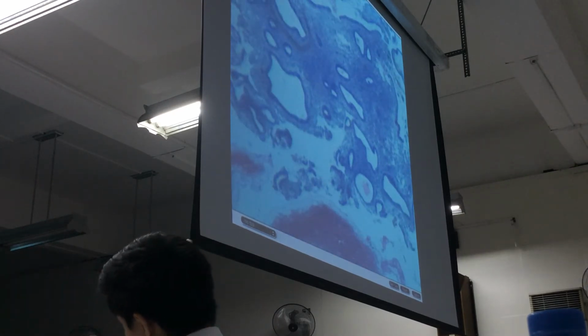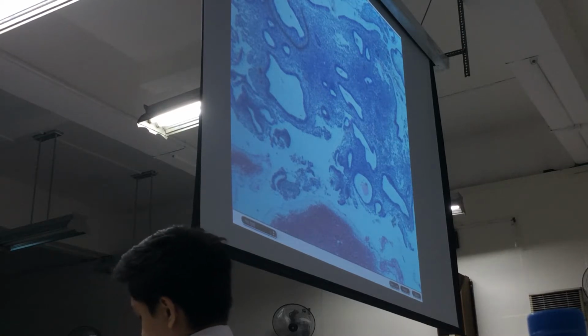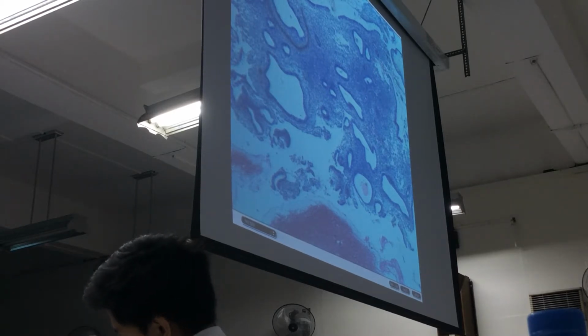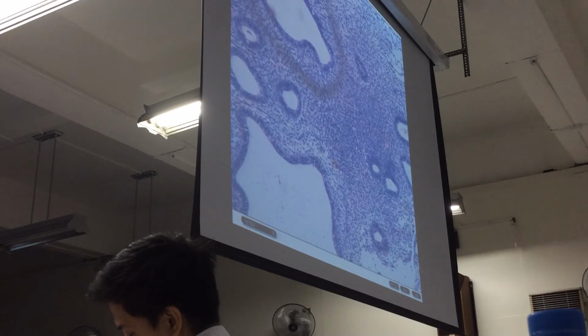This patient usually presents with abnormal uterine bleeding. And on dilatation and curettage, this is the type of endometrial histology you will see. What are you looking at right now? You see vari-sized endometrial glands irregularly distributed in a cellular endometrial stroma. Okay? That's the architecture. It looks like a Swiss cheese pattern. Yung kinakagat ng mga daga sa cartoons.